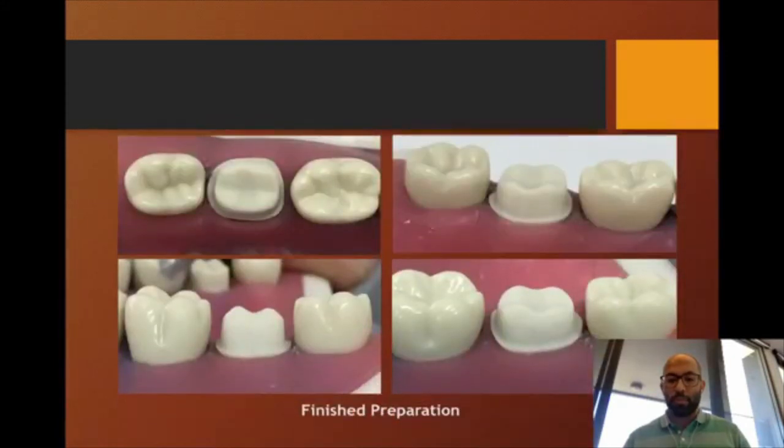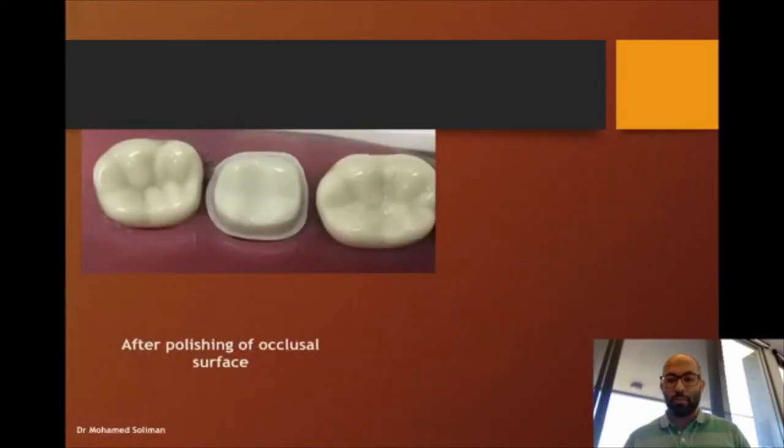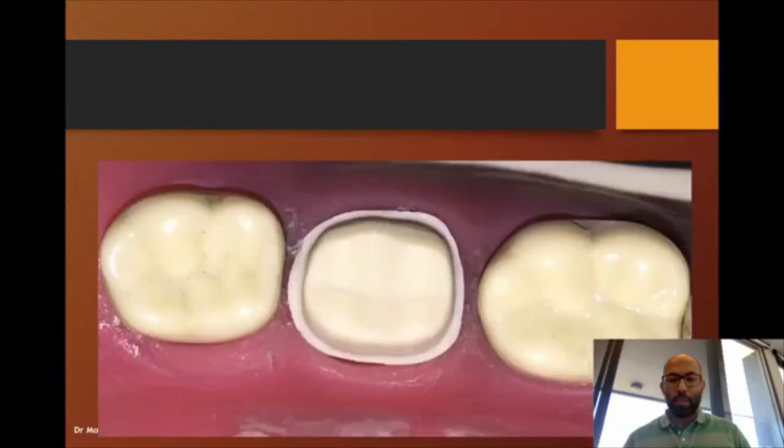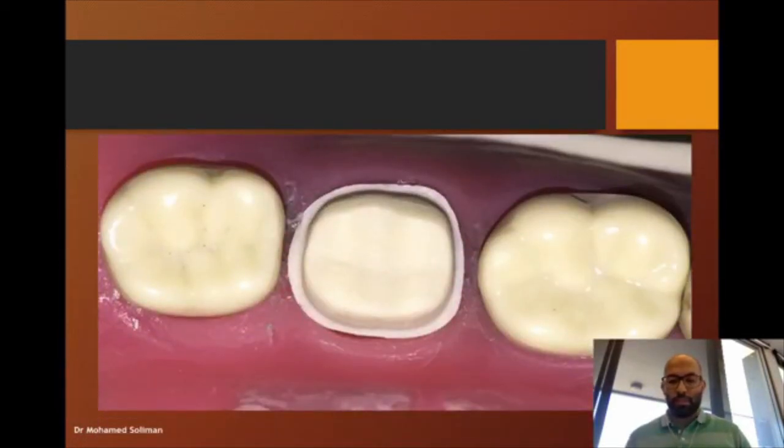Sorry, the next slide is showing the preparation under some light, just to show you that when you look at the tooth from the top view, you should be able to see the margins clearly like that.